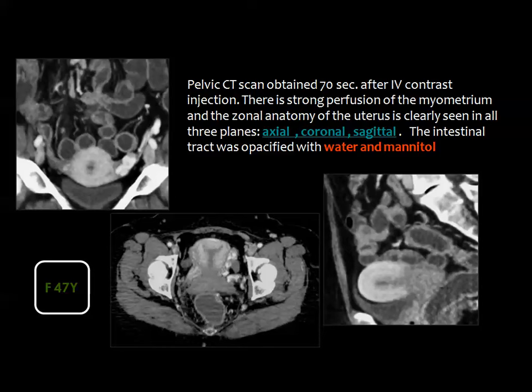We may prepare the bowel using water or mannitol to distend the small bowel loops and separate them from other pelvic structures, but in most cases radiologists are familiar with using gastrographin in the bowel loops. This is the coronal reformatted CT image after contrast injection showing the uterus with the endometrial cavity, and the axial image shows the uterine corpus and endometrial cavity. The sagittal image shows the full configuration of the uterus including fundus, body, and cervical canal.